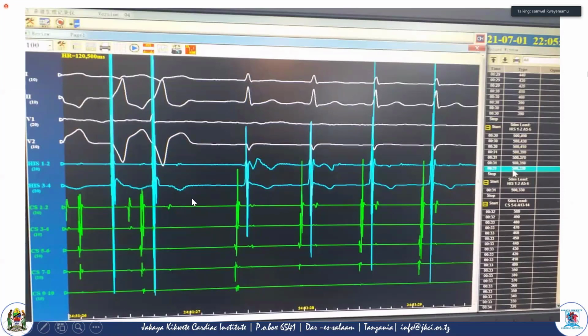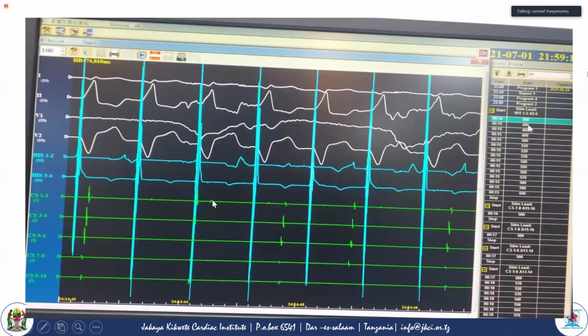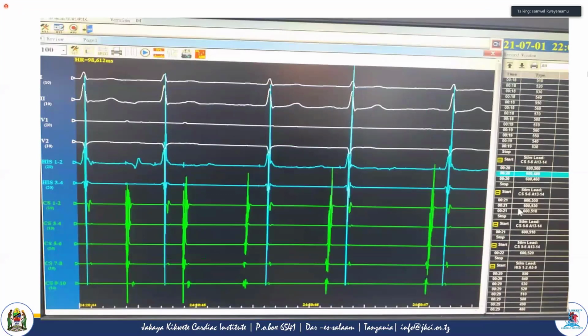So here we are saying this is the retrograde effective refractory period of the ventricle. Going back to the first slide, because there was no one-to-one conduction in this part, we lost conduction when we were pacing the right ventricle. What it tells us is that this patient has no accessory pathway. And when we are trying to induce premature beats in this patient, we don't trigger any tachycardia.